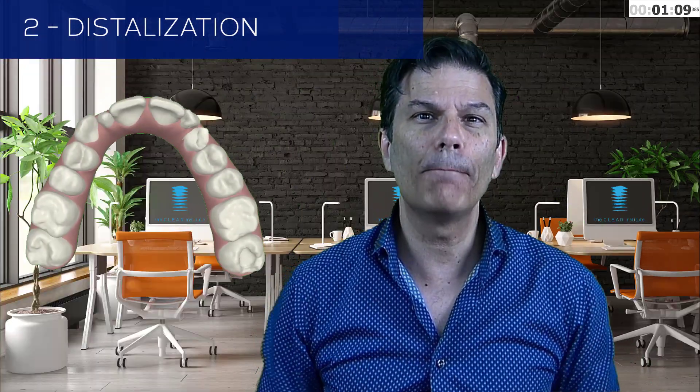Number two: distalization. Can you distalize with clear aligners? How much? Of course, there are multiple ways to distalize teeth. My tool of preference for distalizing is definitely clear aligners.